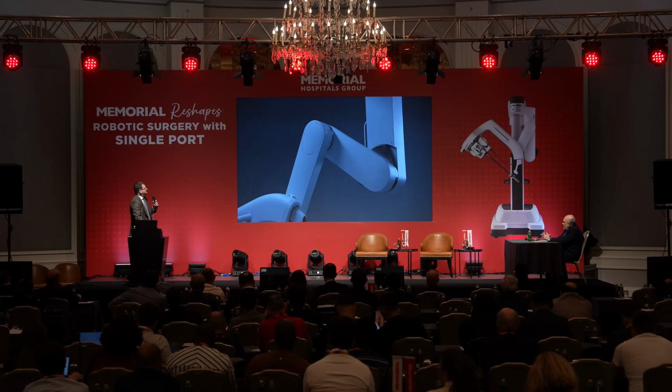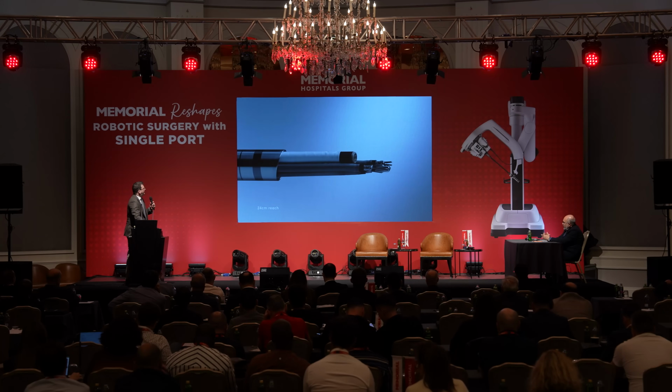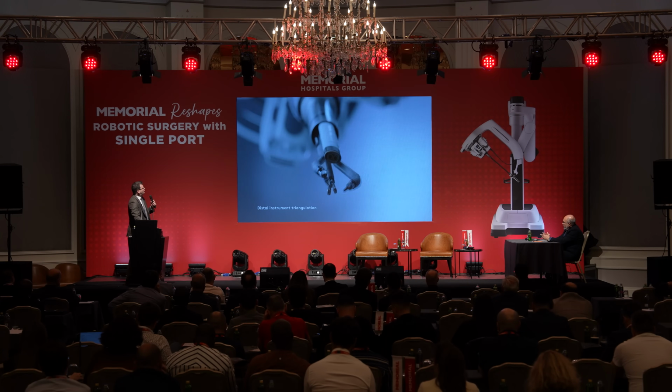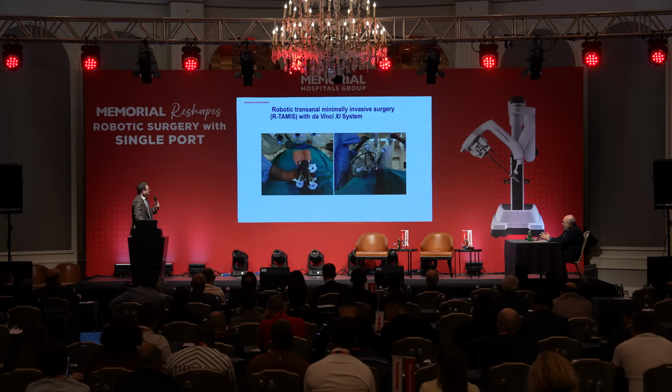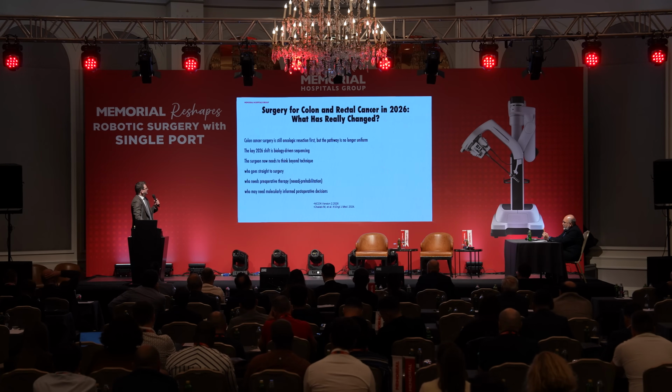Now we have better instruments with the help of technology. The era is coming back again, and we are trying to move forward with fewer incisions. With the multiport technology, we try to do transanal operations from the single site, but this is a very premature application of the instrument. But you can also do local excisions to TME operations with the multiport technology.